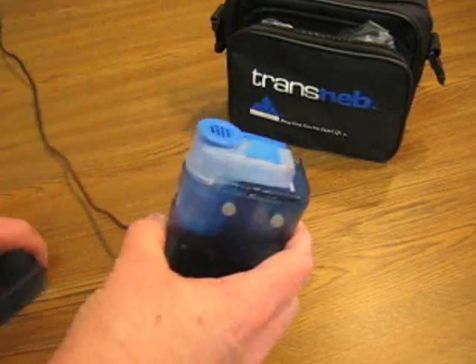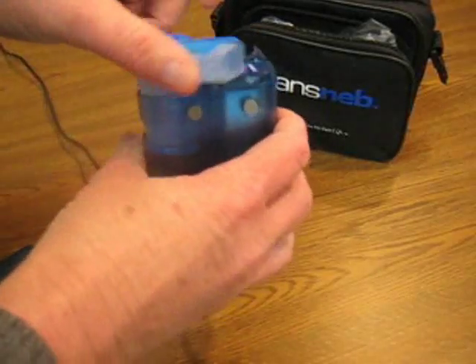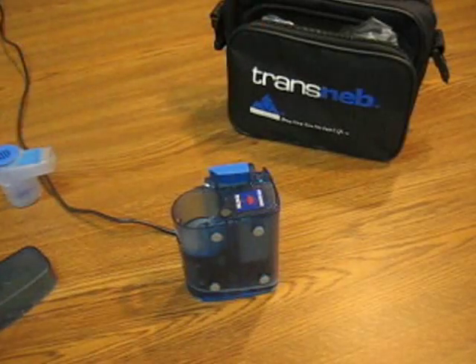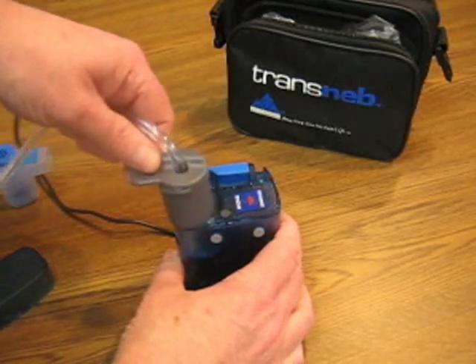With your standard compressor you can take your medication by holding the compressor in your hand, or you can remove the medication cup and take out the adapting tubing that comes with it. There's a large gray end to this with a flange, with that flange sticking outward.